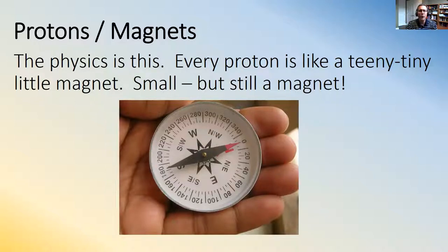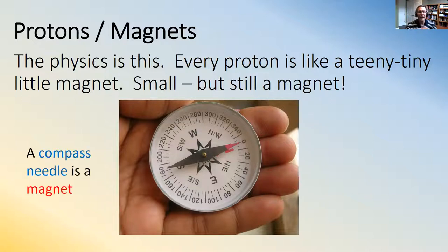How do we talk to the protons in the water molecules in your body? Well, the physics is this. Every proton is actually like a teeny tiny little magnet. It's a small little magnet. It's really small, but it's still a magnet. And you guys know something about magnets because you're used to refrigerator magnets and you stuck stuff to walls, and you know what that magnetic field feels like when something that's magnetic gets attracted to something else. And the example I like to use is a compass needle. A compass needle is a magnet.